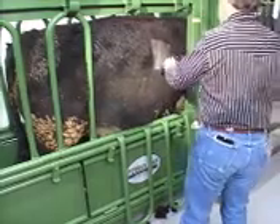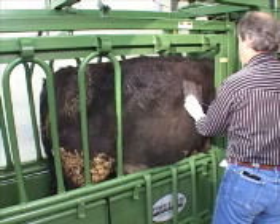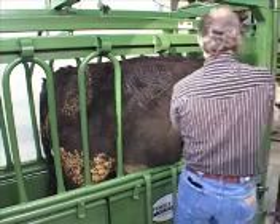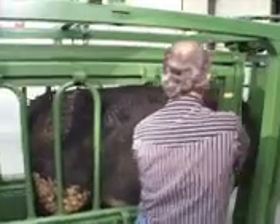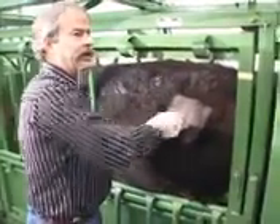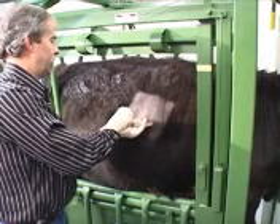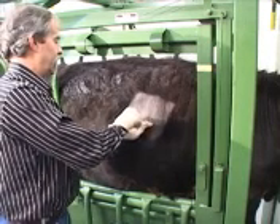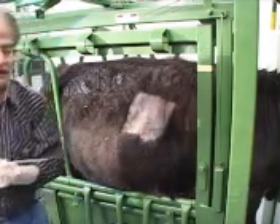Did everybody see that? Okay. When you actually do the biopsy, you'll come in. I actually will touch both sides of the ribs because I want to go halfway between the two ribs. I'll actually aim it about 15 degrees down and 15 degrees forward and just push into the intercostal muscles. I actually will feel a little bit of resistance as it goes into the liver. Then I just push the stylus forward.